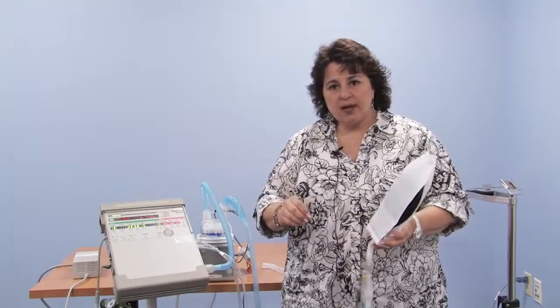But that number is important for you to know, because if you go home next week, or next week this ventilator is initiated in your home, and 3 liters is fine, and then 2 weeks later, things aren't quite right, the child has a little runny nose, and you're putting 5 liters in for the same oxygen saturation, there's a change. So you want to be able to tell your doctor, not necessarily that my child went from 40% to 60% like we do in the hospital, but that we had to go up from 3 liters to 5 liters. We need more oxygen to get the same oxygen level in our child. There is a change, and it may be something respiratory.